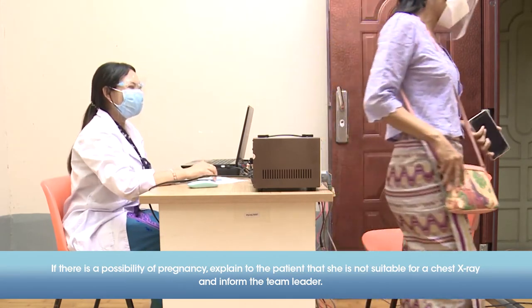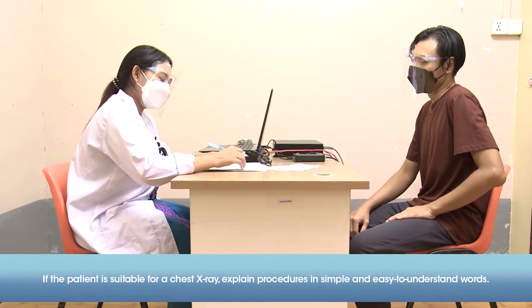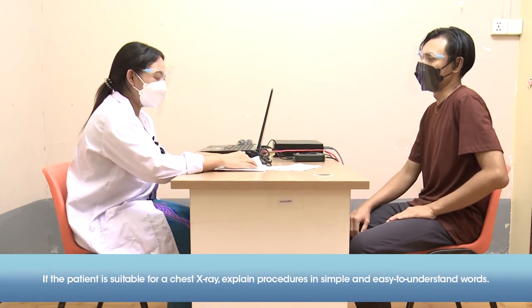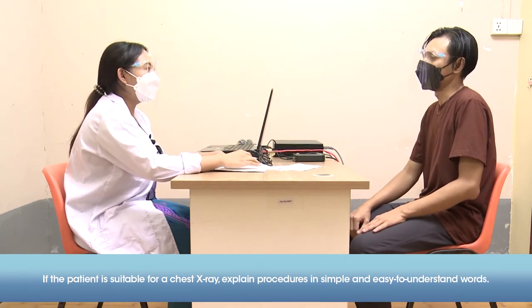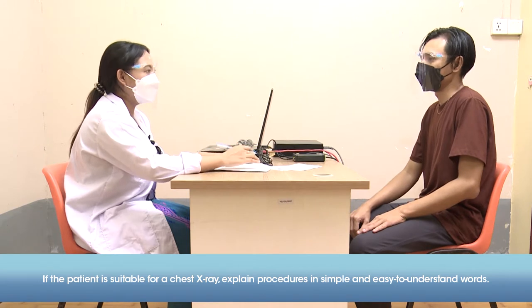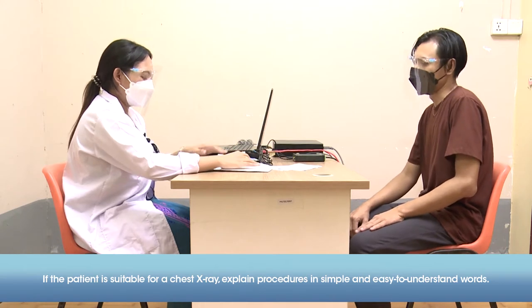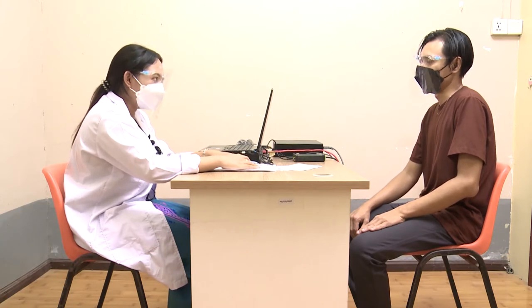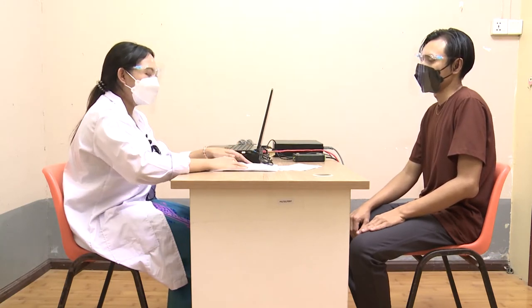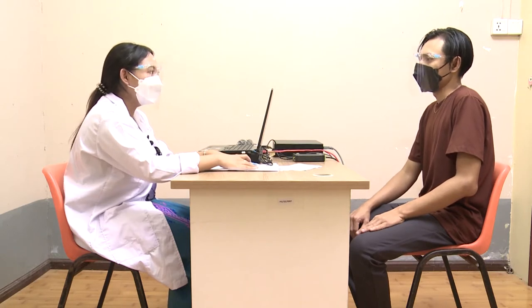If there are no concerns around the patient's exposure to radiation, describe the procedure in simple, easy-to-understand terms: "We're planning to take a chest x-ray today because the doctor referred you for one. You will change into the gown we provide and remove any jewelry like a necklace. During the procedure, you'll do an easy breathing exercise — inhale deeply when we tell you to and hold your breath. We'll tell you when you can exhale and breathe regularly. This will expand your lungs so that we can get a clear picture for correct diagnosis. Thank you for your cooperation."